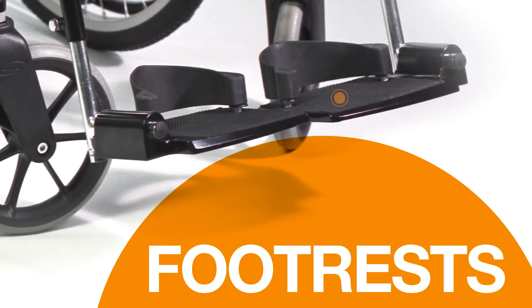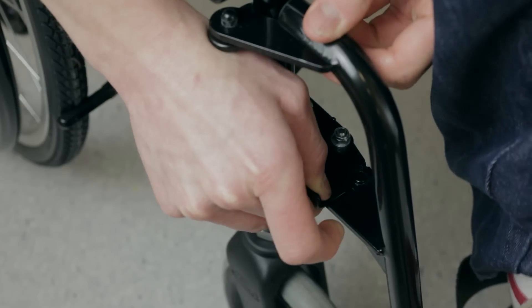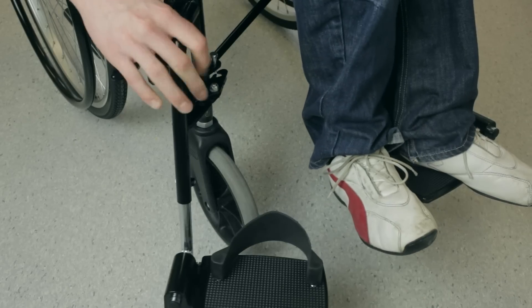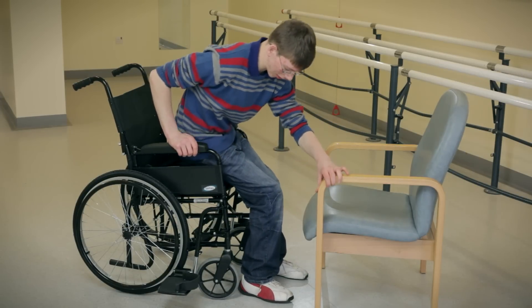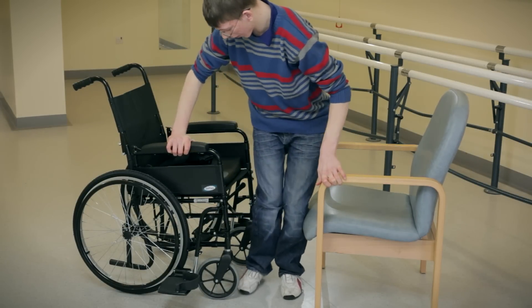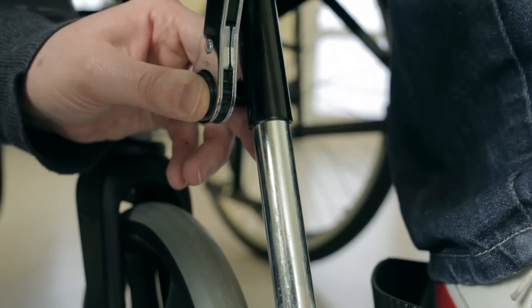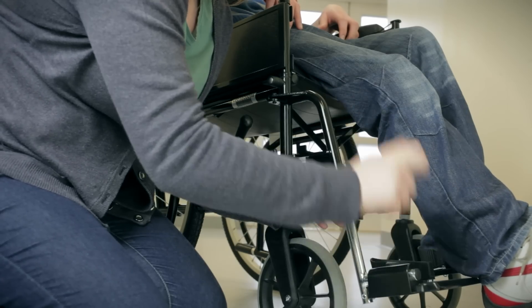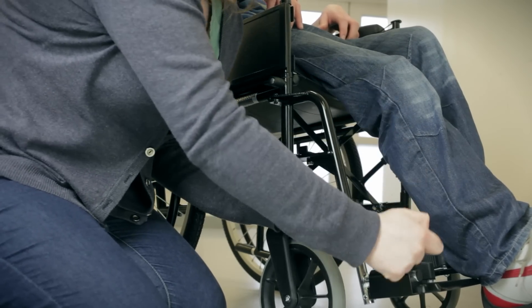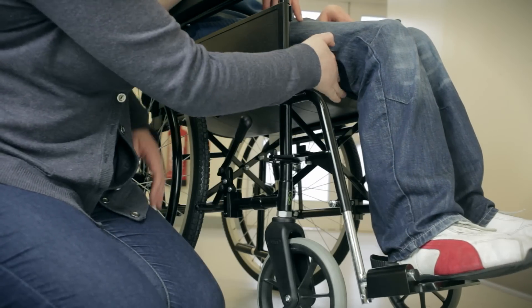Footrests turn up to make it easier to get into the wheelchair. If the chair has swing-away hangers, they should be swung away before getting into or out of the chair. It's important never to stand on the footrests, as this would cause your wheelchair to tip forwards. The distance from the seat to the footrests can be adjusted to fit you more comfortably. If you need adjustments to your footrests, please contact your local wheelchair service for advice.